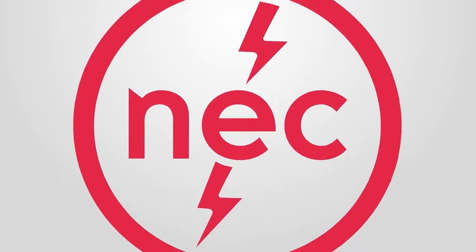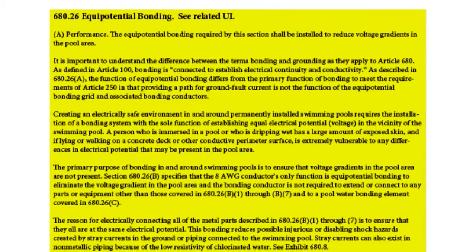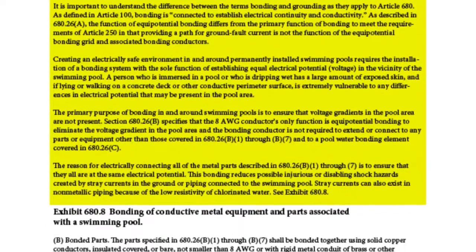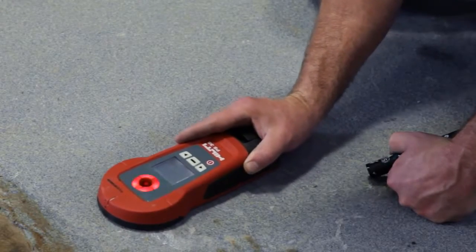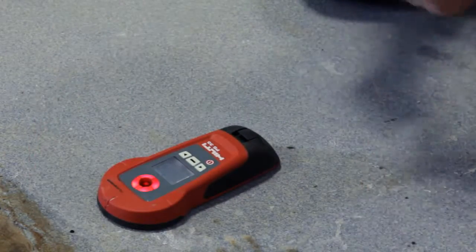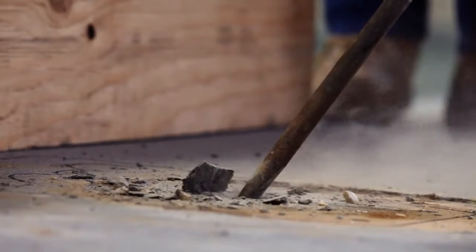The National Electric Code states that permanently installed pool lifts or permanently installed anchoring parts must be bonded in compliance with 680.26 of the NEC code. To bond the lift, the installer must locate the rebar, which is embedded in the pool deck. He then cuts out an area in the concrete to gain access to the rebar.